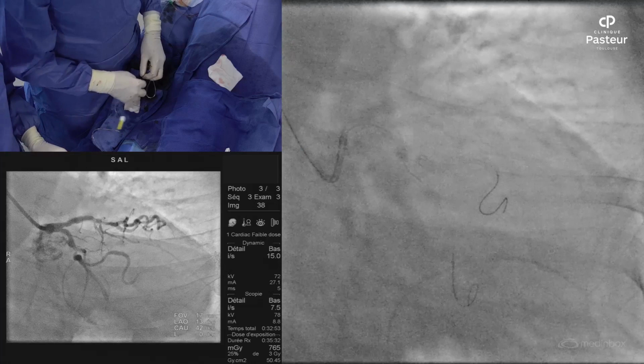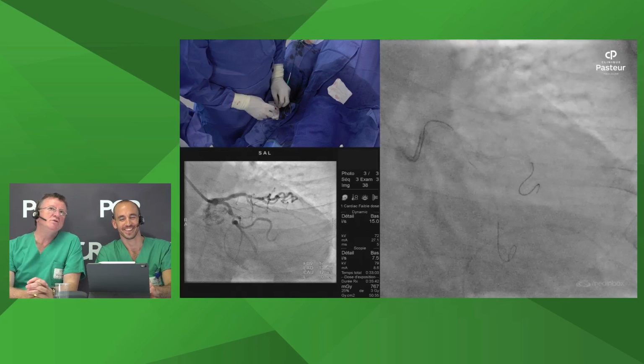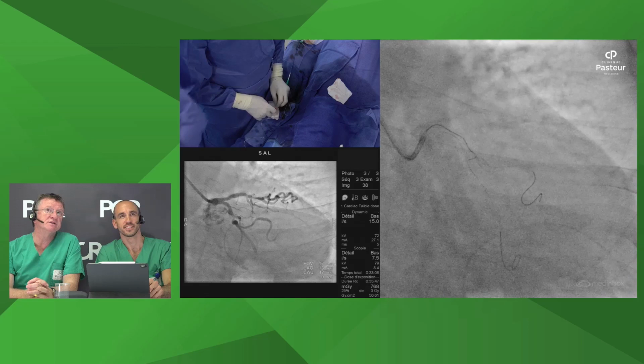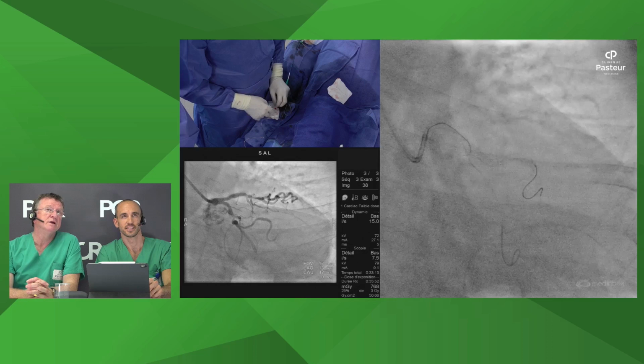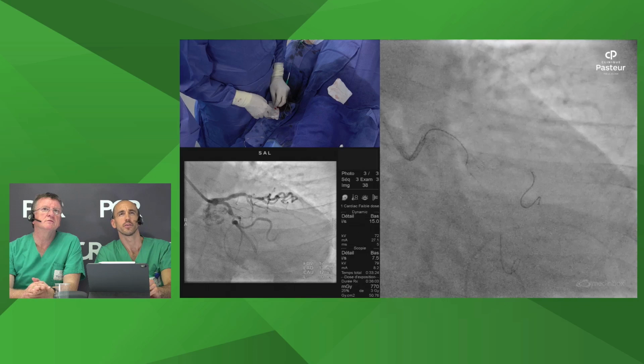So the patient can answer and ask questions. So it's not a very deep sedation. Indeed. No. Well, I think there's a lot to be gained from sedating patients in certain circumstances. And with a complex, difficult and long case like this, having a comfortable patient free of distress during the procedure is a useful thing. Look, the position of the guide wire, I think, is better on the ostium of the circ.